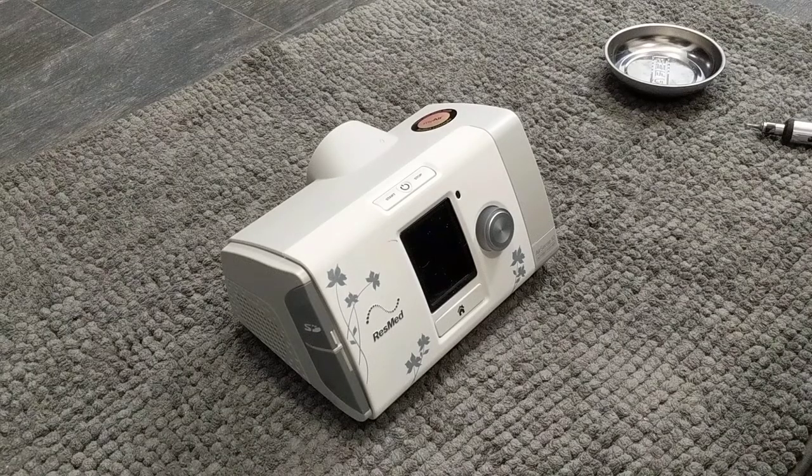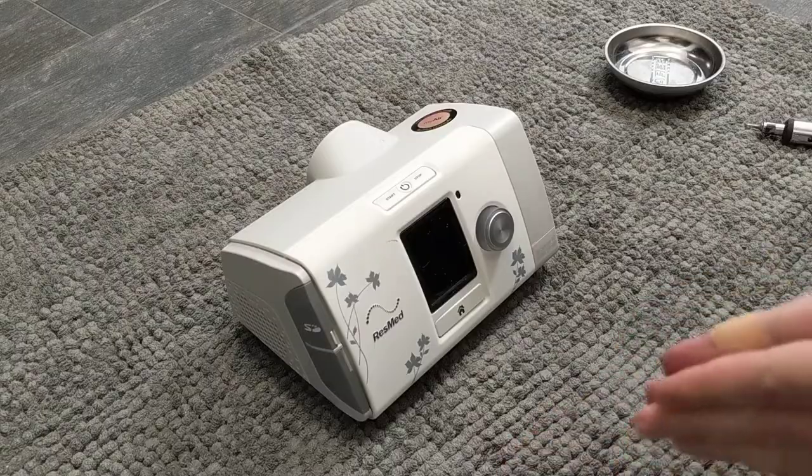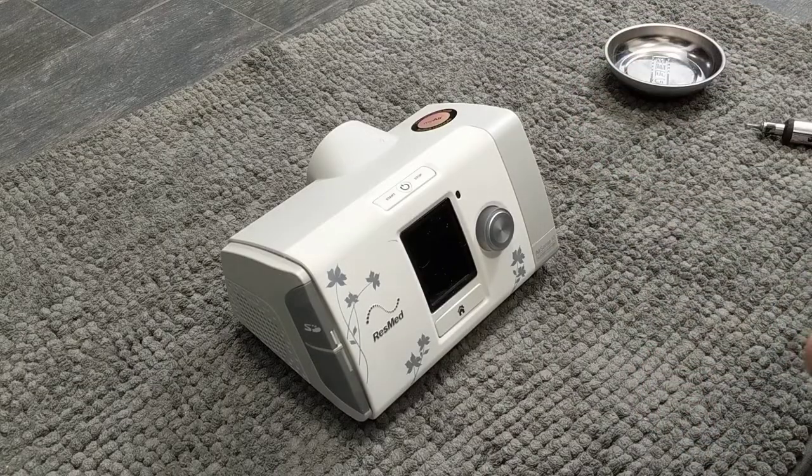This is the disassembly of a ResMed AirSense 10 AutoSet. This is the 'for her' version, but it's going to be the same whether you get the one with the additional 'for her' algorithm or the black one with only the original algorithm. I'm going to show you how to disable or remove the modem, then go deeper into the internals for a deep cleaning.